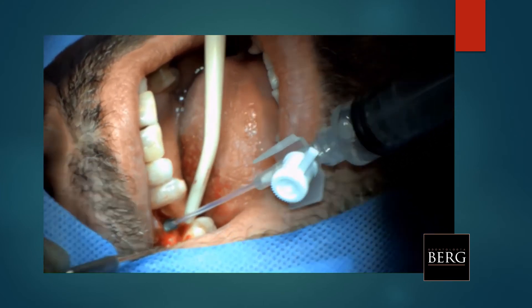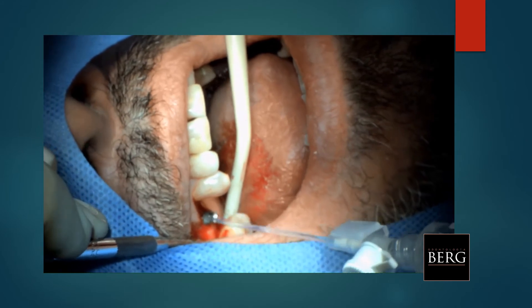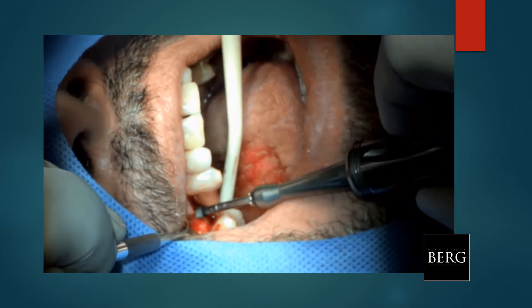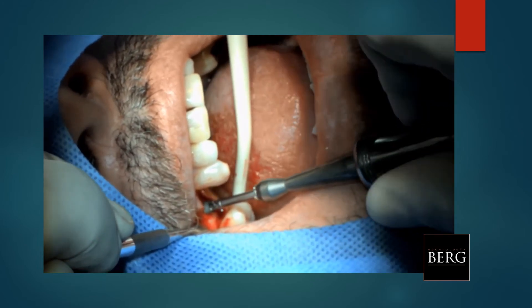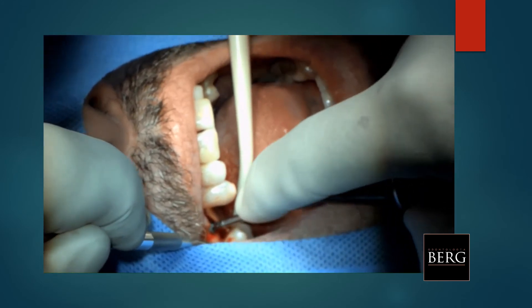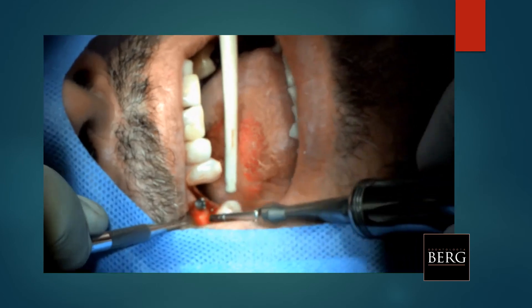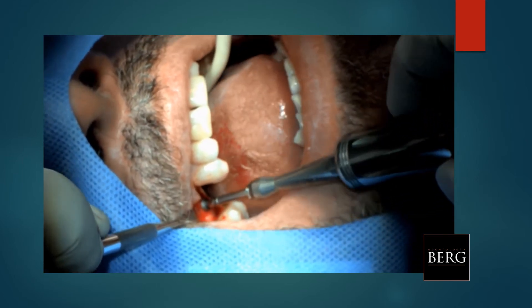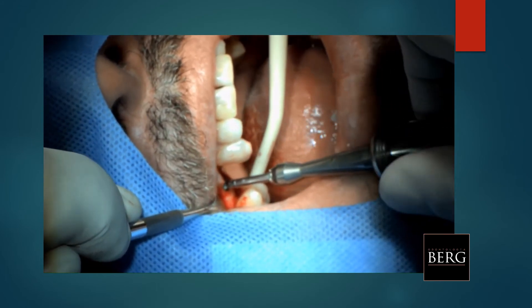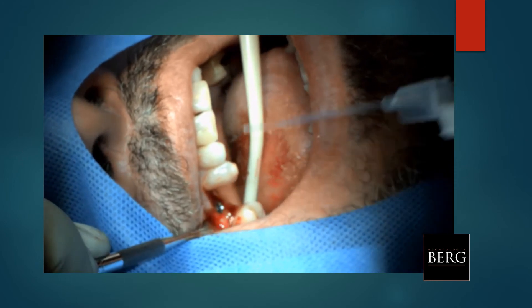Another cc of saline — this is pretty much real time. It only takes a few minutes. The patient breathes in, and the pressure takes the saline out. Another cc, and we're finalizing our implant in about 10 minutes for a full sinus lift. The last cc — I usually use a little more, maybe two cc's on the last one, just to ensure. We keep checking the integrity of the membrane. Another turn — this time we take care that the flat side of the hex faces vestibular. We are going to gain a little more depth.